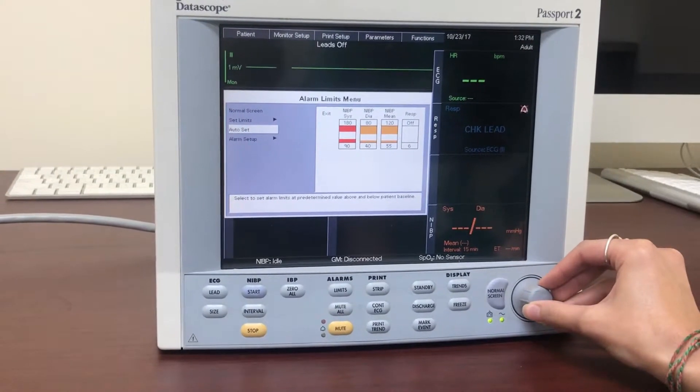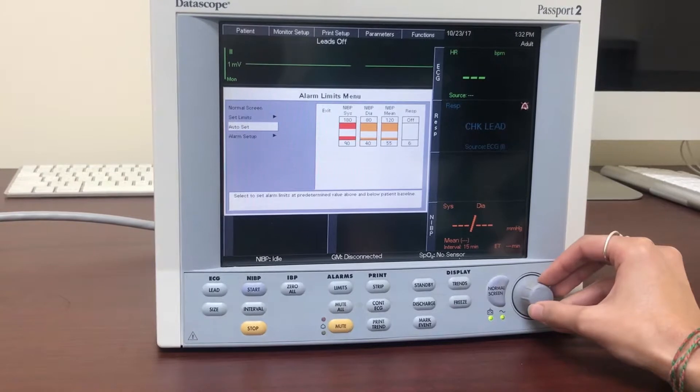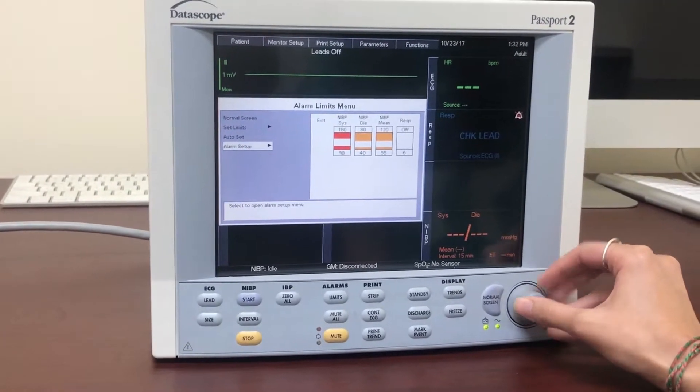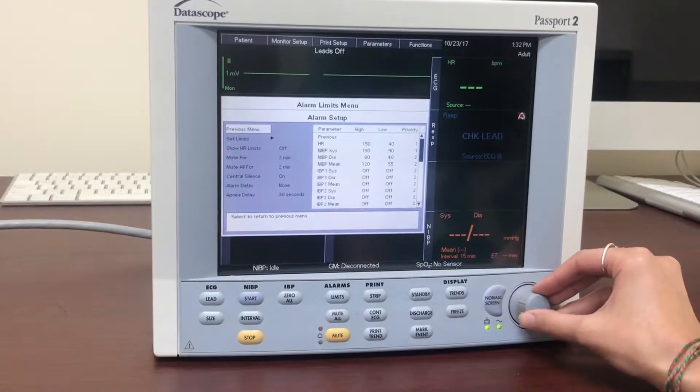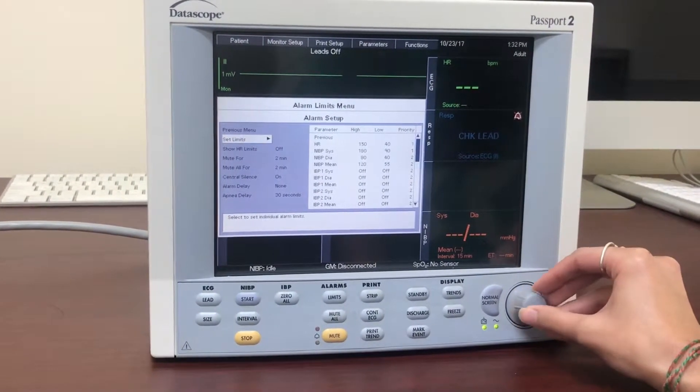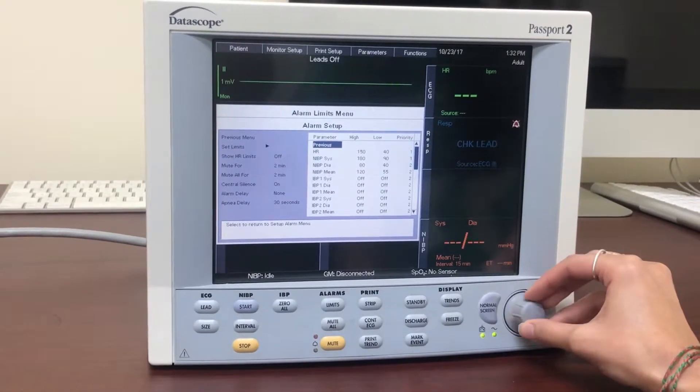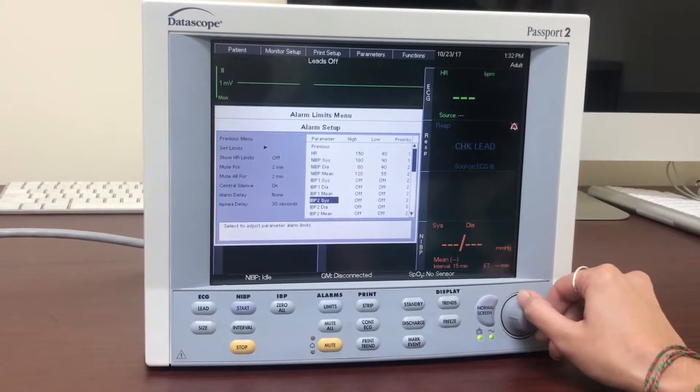Auto-set will set alarm limits according to the patient's baseline vitals. The alarm setup section will allow you to change alarm limits for various parameters as well as set mute periods, alarm delays, and turn alarms on or off.